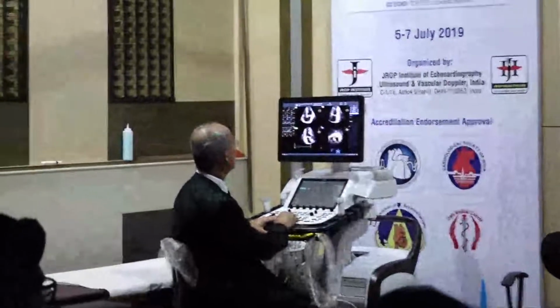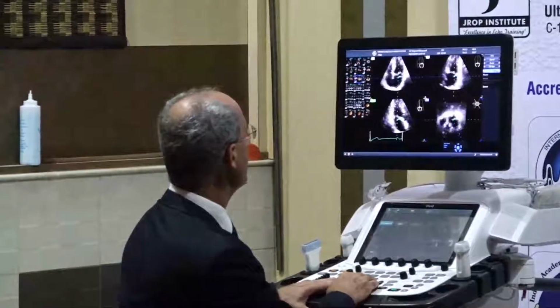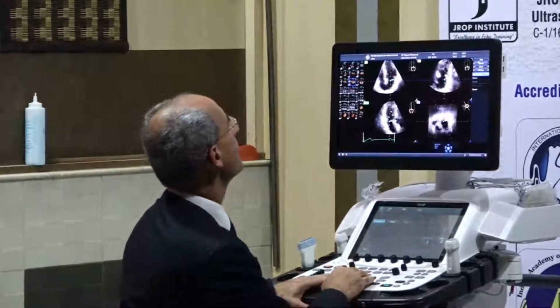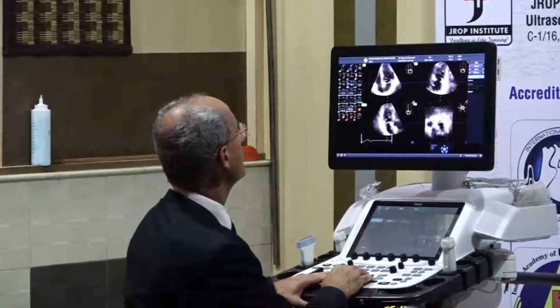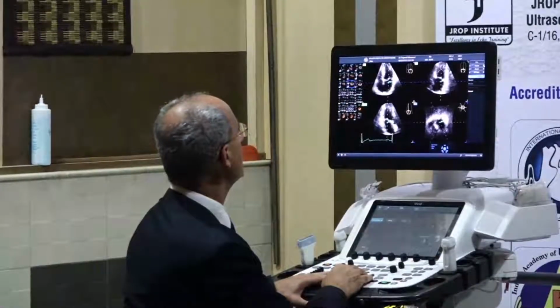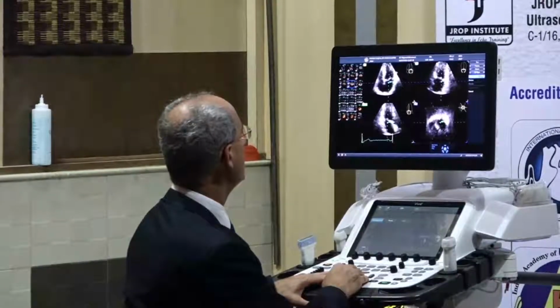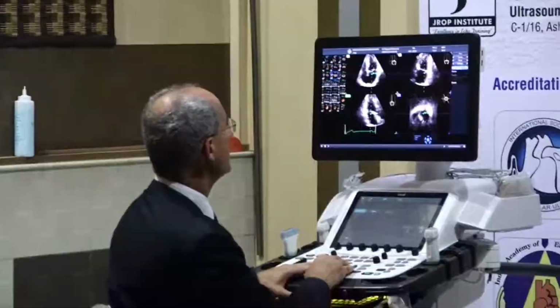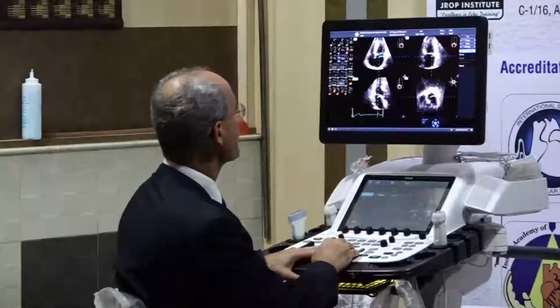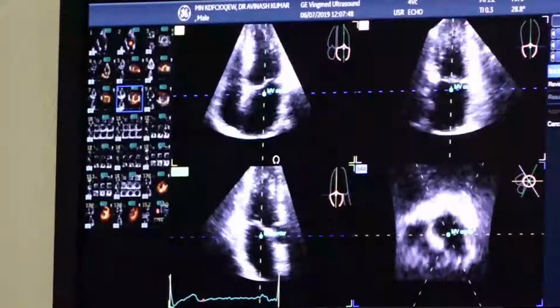Using your translating and tilting options, we will have the left atrium passing through the center of the mitral annulus and the roof of the atrium. And this should be done in all three views. Like this and like this.